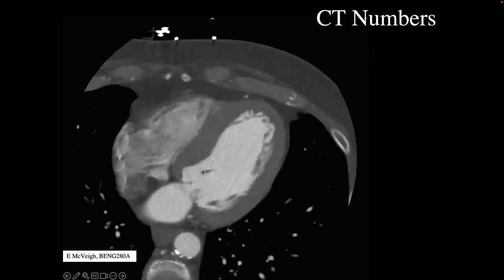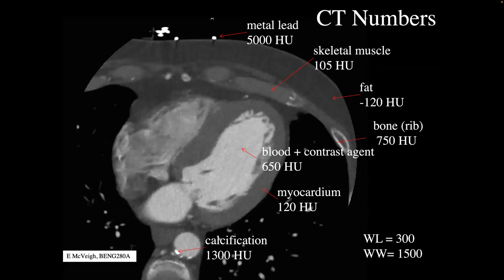But it's more interesting to look at a picture like this. So here is a modern CT image. When you put a region of interest here and ask what the pixel values are, in skeletal muscle in this patient it's 105 Hounsfield units. So there's slightly more attenuation here than in water. Remember, water would be zero. Fat, in this subcutaneous fat here, the Hounsfield unit is minus 120, which means there's slightly less attenuation than in water.